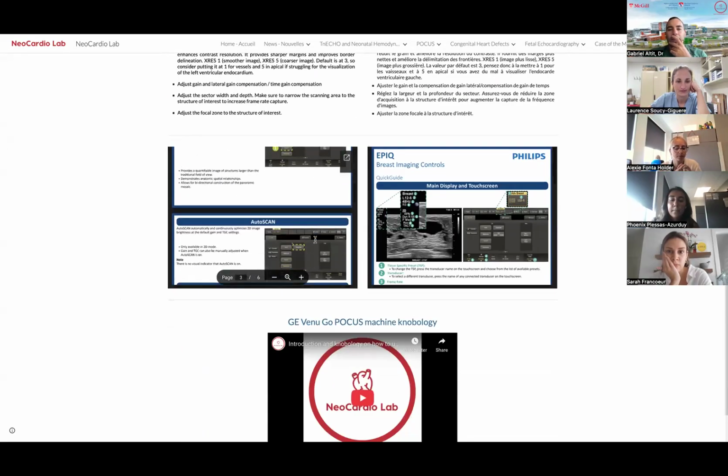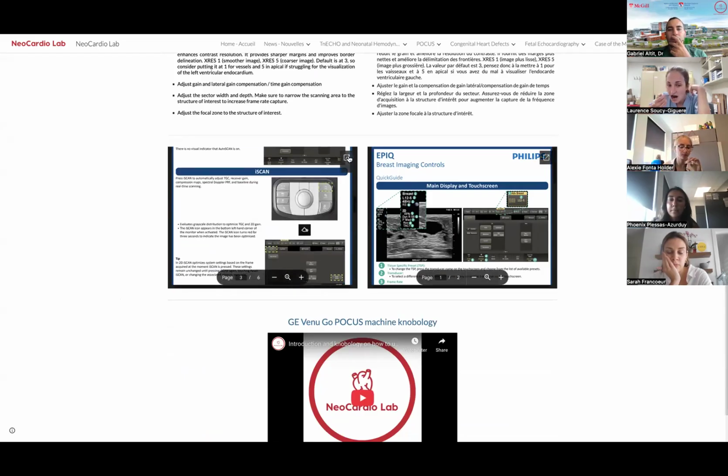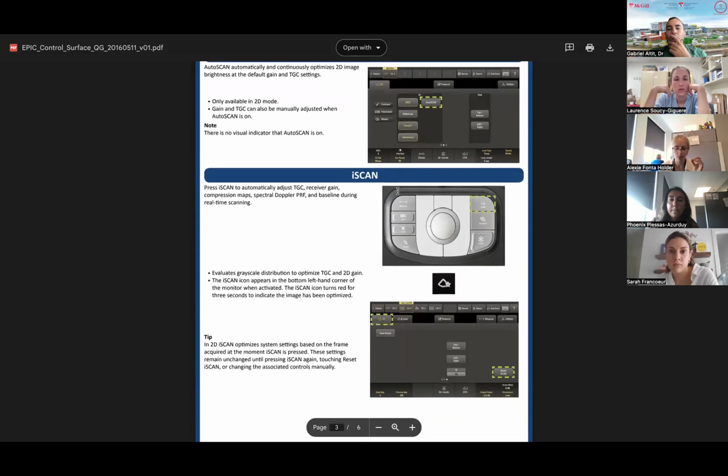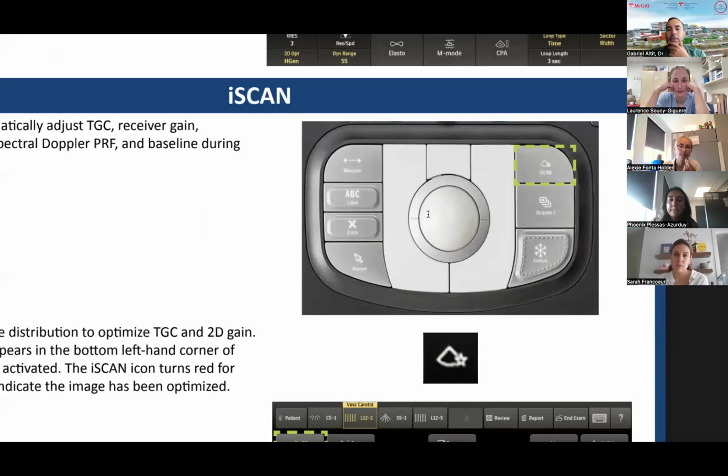So let me open and see if I have a keyboard. I'll show you an example of some of the keyboard functions that you'll see. The way the Philips functions is that you'll have in the middle of the keyboard this little ball, which serves you to move around either your cursor, your line of interrogation, or your mouse if ever you're clicking here and you're using the pointer. Then within the first few elements that you'll see, there's a button here, a button here, a button here. So they really act a bit like a mouse.